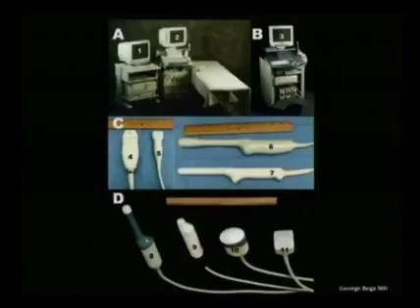So this is a picture, a composite image of a number of equipment. Here in A, you see that this is a freehand acquisition setup.